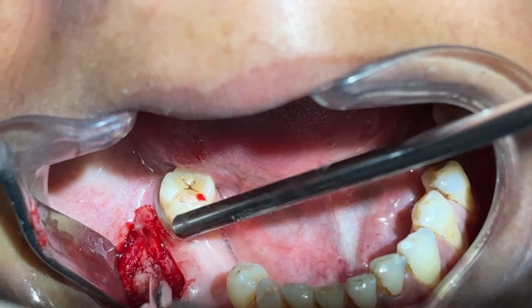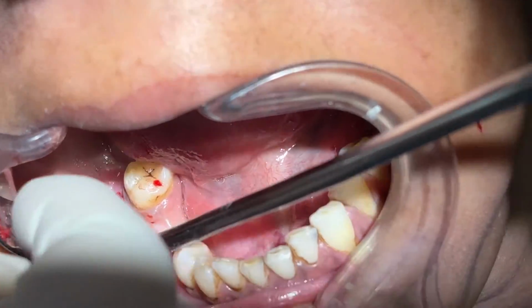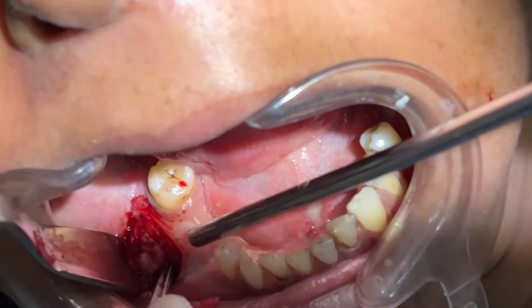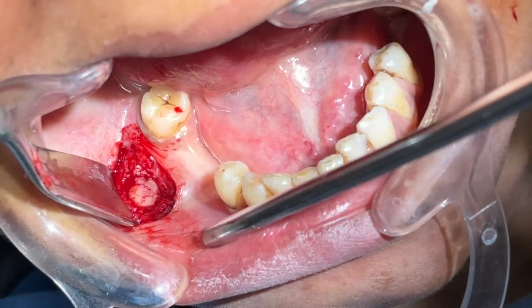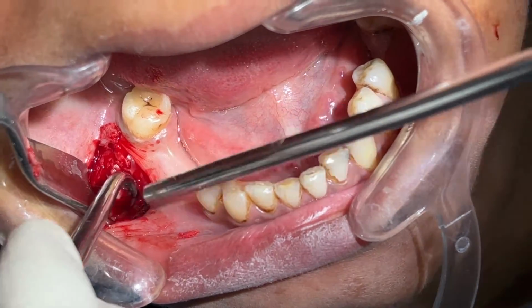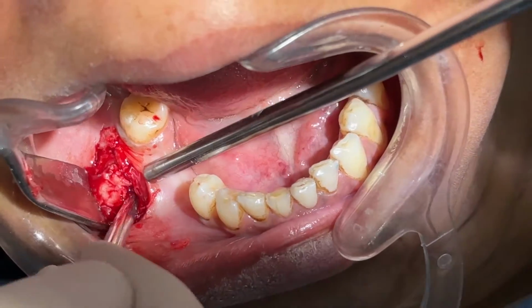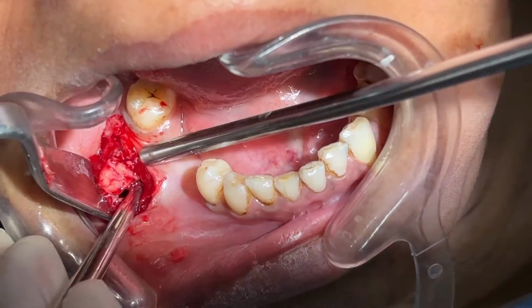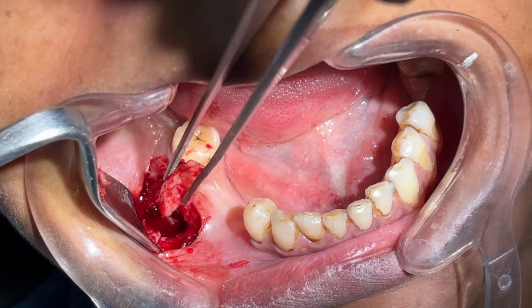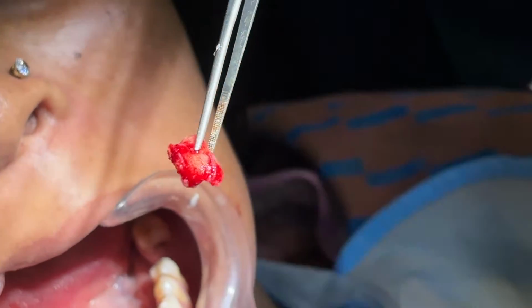I will try not to break or crush the tissue, so I am going slightly deep to take a good amount of tissue. Now I can use this curved instrument to scoop out the tumorous mass, and that is how we get a good chunk of tissue, as you can see.